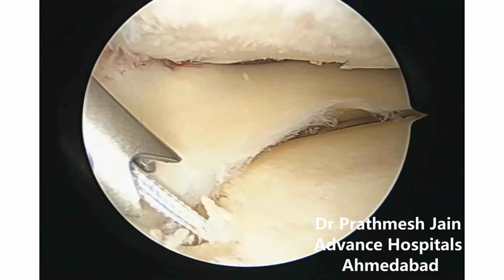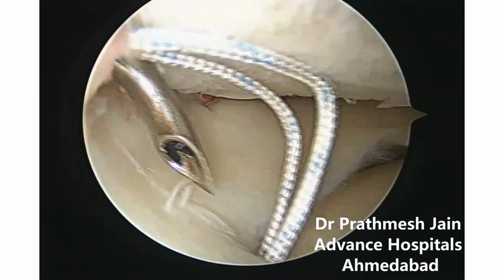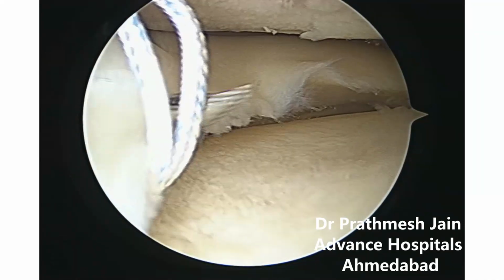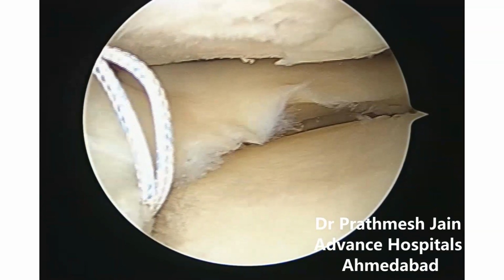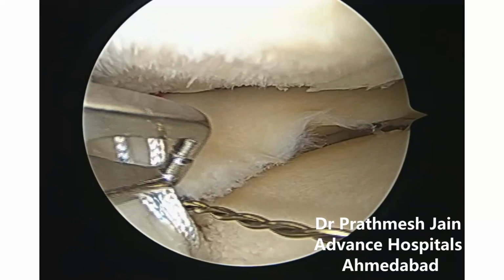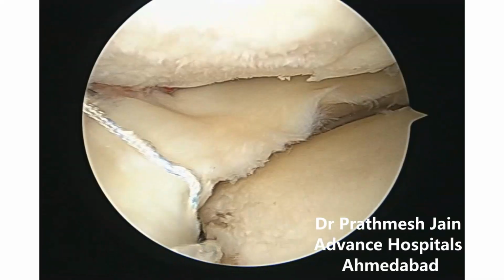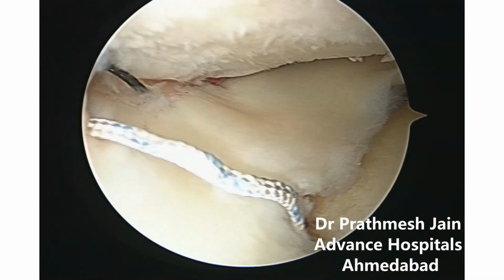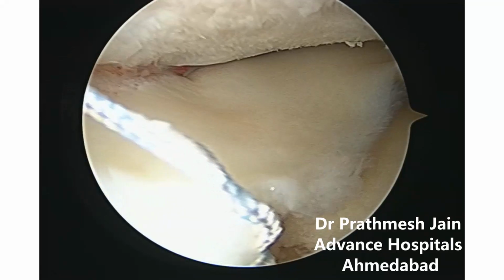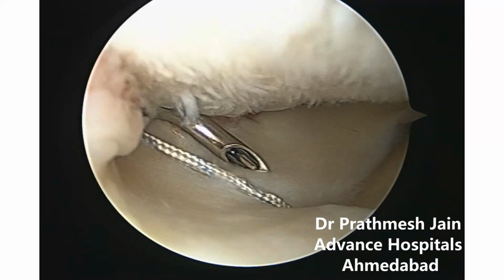Once this anchor is put, we will use specific techniques. We can use suture shuttles. In this particular case, we are using an ideal suture shuttle, and we need to pass the ideal suture shuttle 2 times to railroad both of the two sutures through the meniscus periphery. So this pass is usually at the meniscocapsular junction, and we will pass the suture along with the shuttle through it. So the suture will eventually pass the meniscocapsular junction. Once it passes through, we will repeat this step for the other suture. Once both of these sutures are passed, we are ready to go for the meniscus root repair.